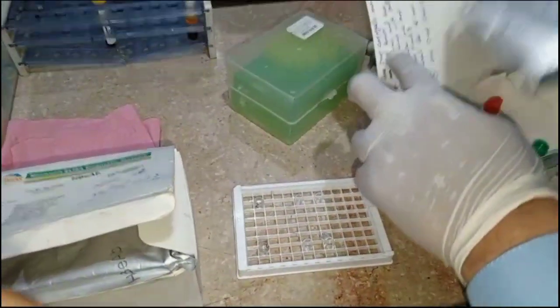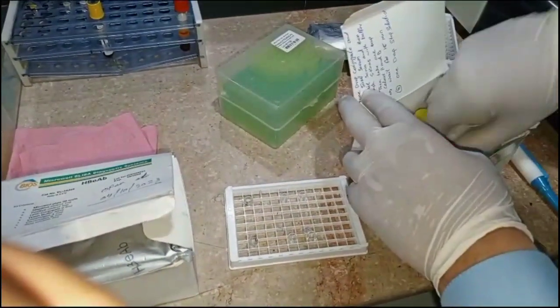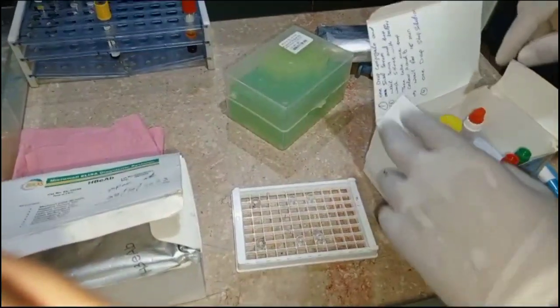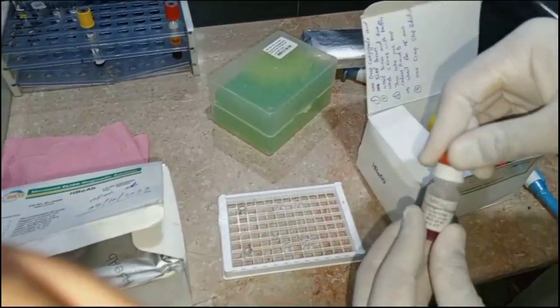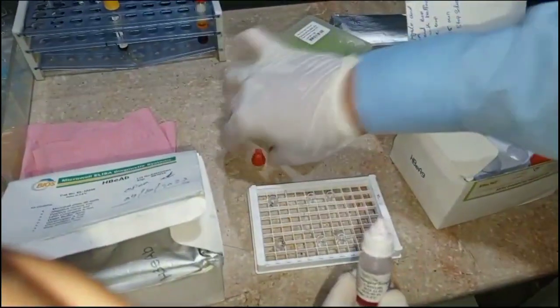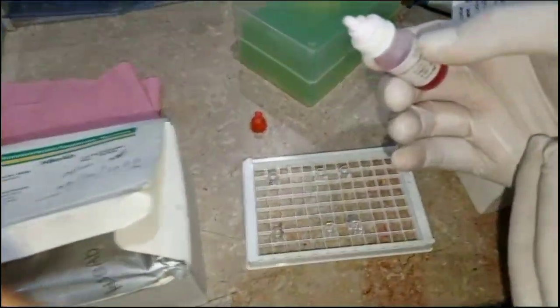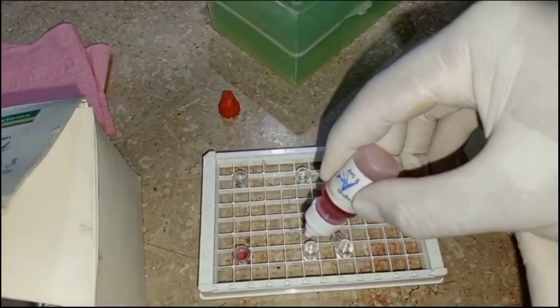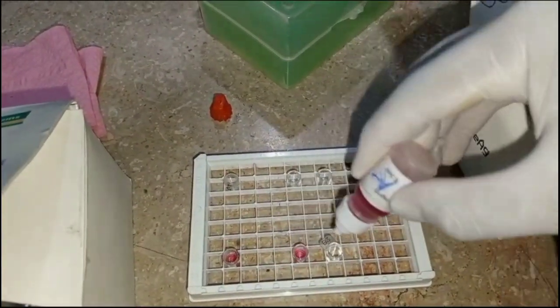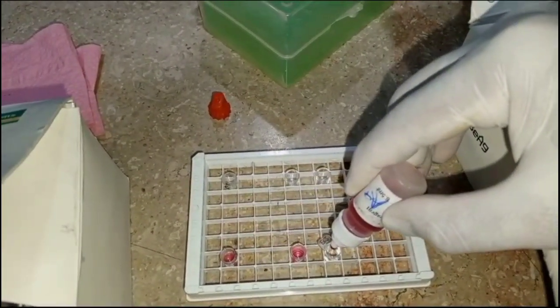So next we should add conjugate. We should add HBeAg conjugate into the Ag portion, that is the lower portion, and then we should add Ab conjugate to the HBeAb portion, that is the upper portion. So we should add 1 drop of conjugate.